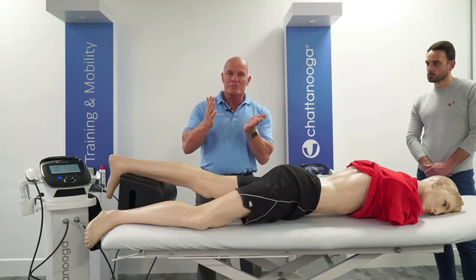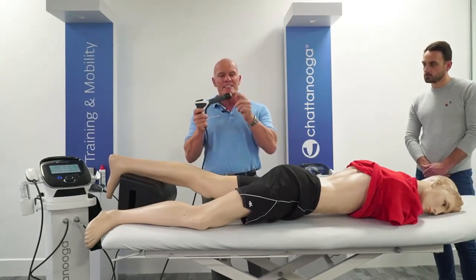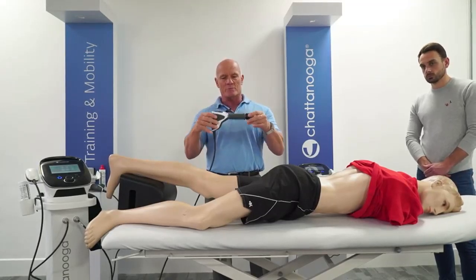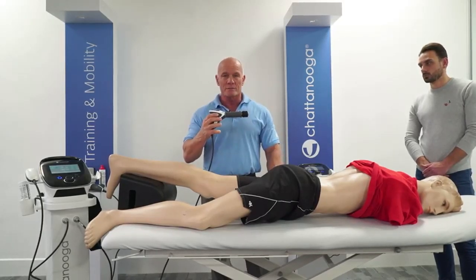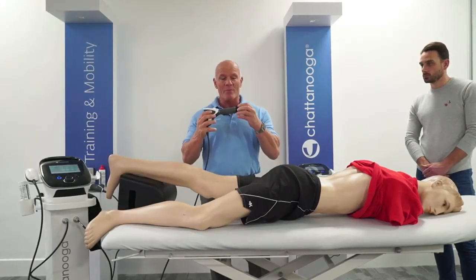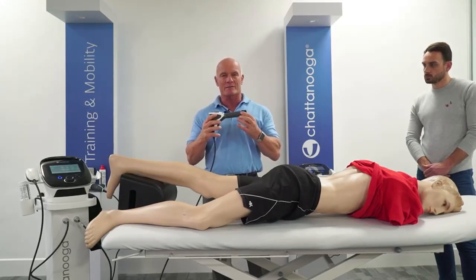Not so much energy. Okay, so this is the really important part. People will come to you and tell you that their machine has 5 bar and 21 hertz. I want you to say, very interesting, but how much energy is coming out of your standard transmitter? Because that is what's going to have the effect on my patient.